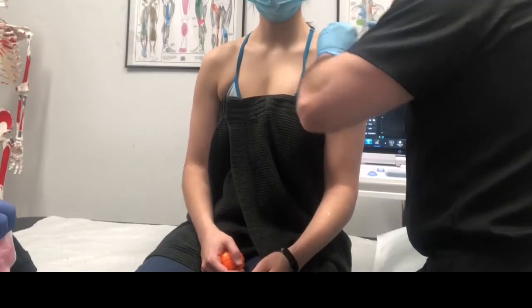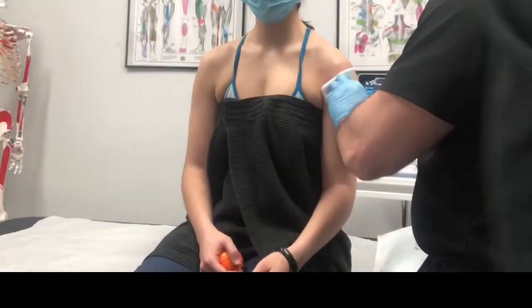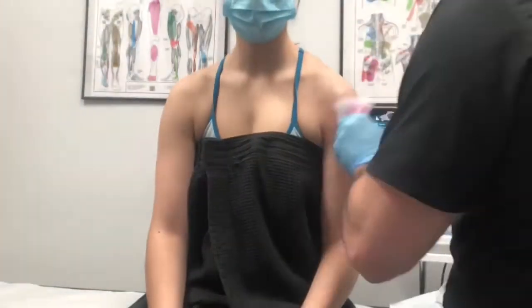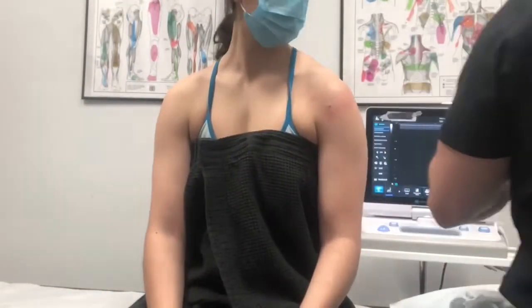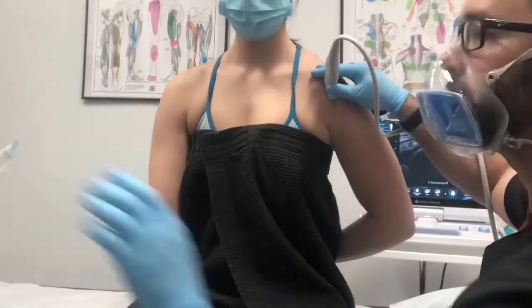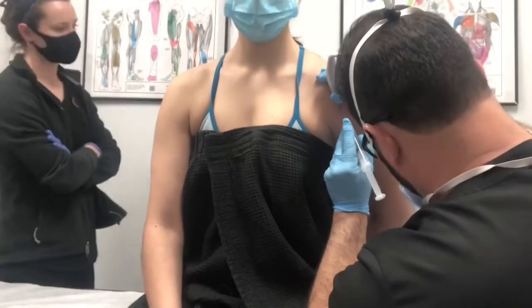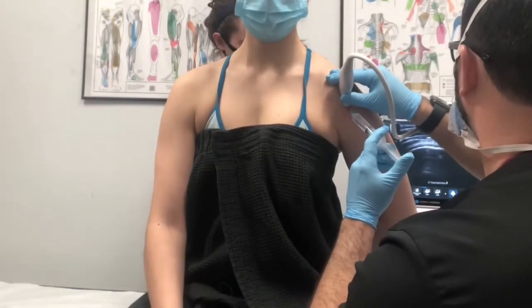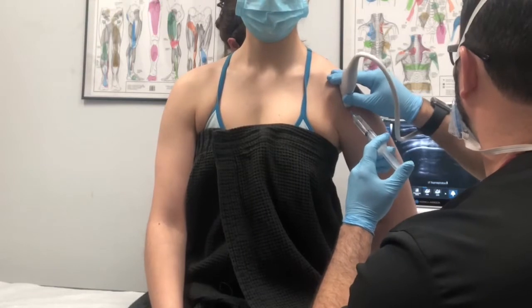As you can see, we're doing it from several different spots, but we numb it up good so it doesn't hurt, to be able to get all the different areas of the rotator cuff that are affected. I'm using musculoskeletal ultrasound to properly locate the area so that we can safely do the procedure and ensure that we're treating the area that needs it.